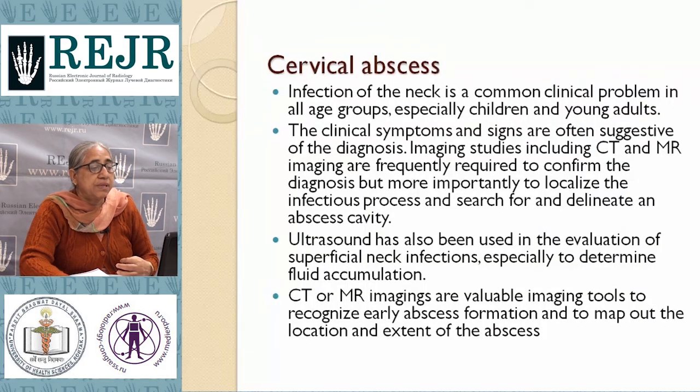Cervical abscess may be seen in children and in young adults, and the clinical symptoms and signs are often suggestive of the diagnosis. Imaging studies, including CT and MR imaging, are frequently required to confirm the diagnosis, but more importantly, to localize the infectious process and search for and delineate an abscess cavity.